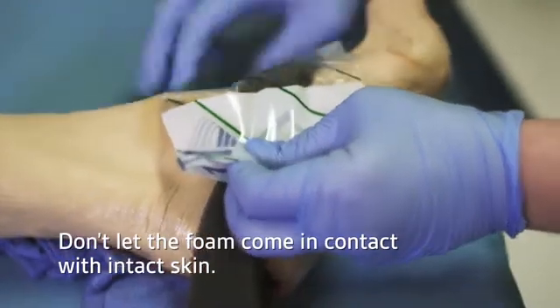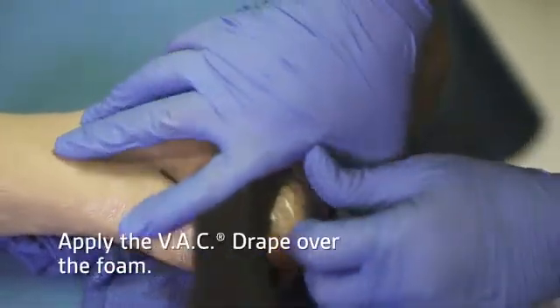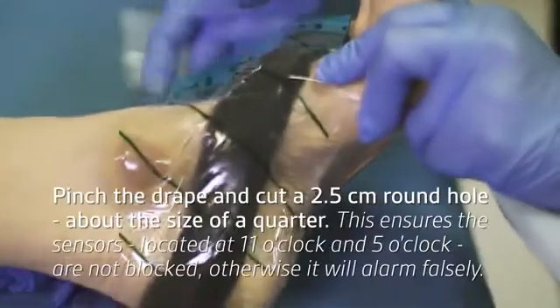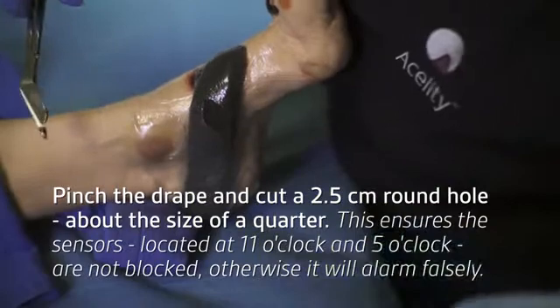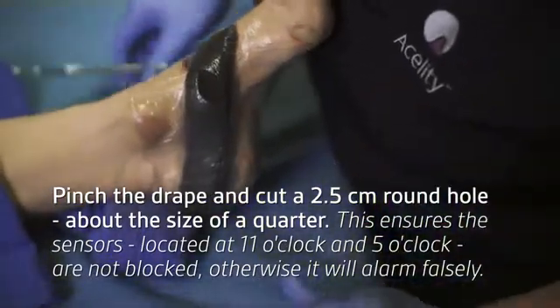Apply the VAC drape over the foam and extend it to the anterior aspect of the foot, covering both the wound and the C-shaped piece of foam to obtain a seal. Pinch the drape and cut a 2.5 centimeter hole on the anterior aspect, then apply the sensor track pad.